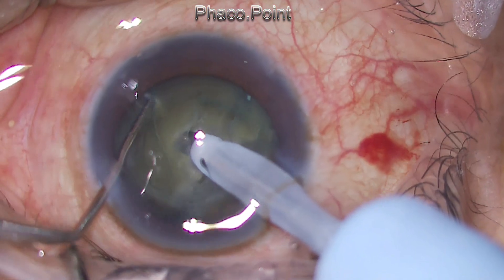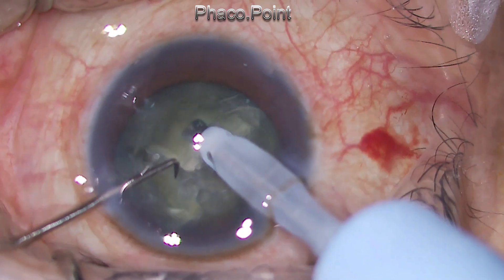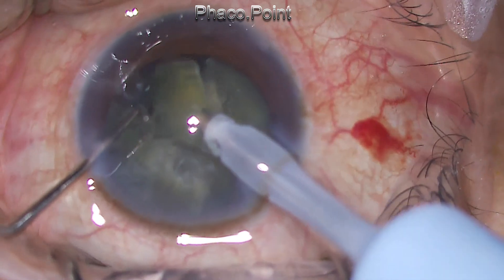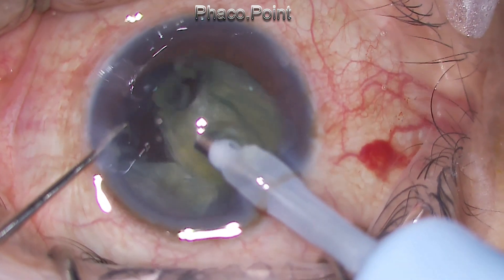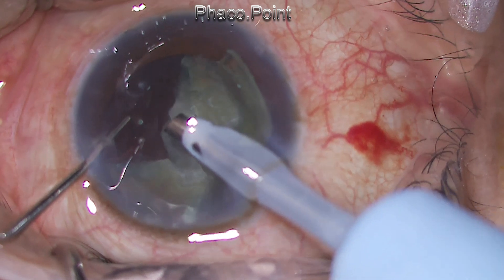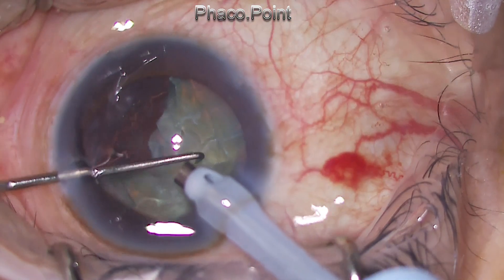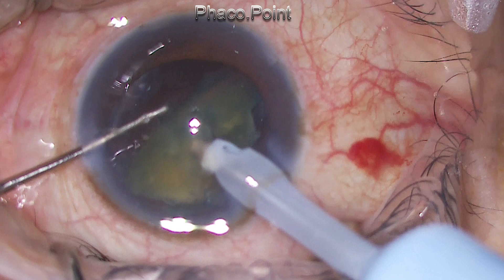So after I create the fragments, mechanical energy is primarily used to break down the nucleus into smaller size fragments. Once the fragments are created, it is very important to use FACO power rather than mechanical force to break them down. Please note that for fragment removal, I am using the same settings that my consultant used: a FACO power of 30% and a vacuum of 300 millimeters of mercury. The FACO power is in pulse mode at 40 pulses per second with a duty cycle of 40%.